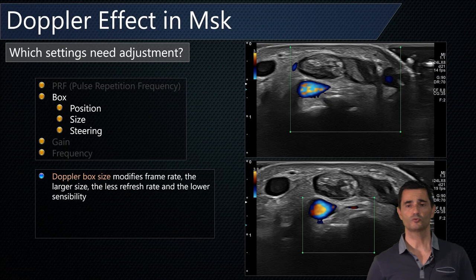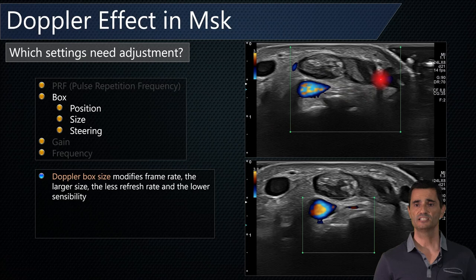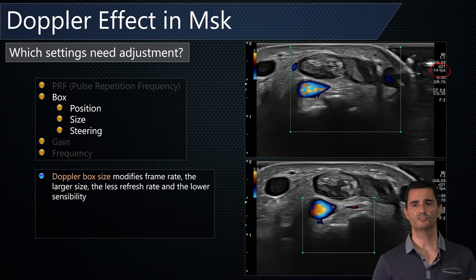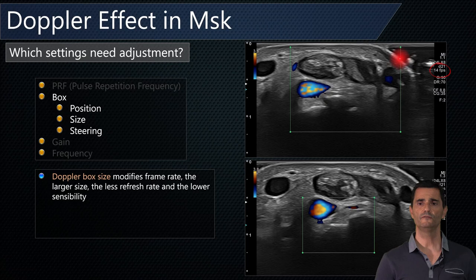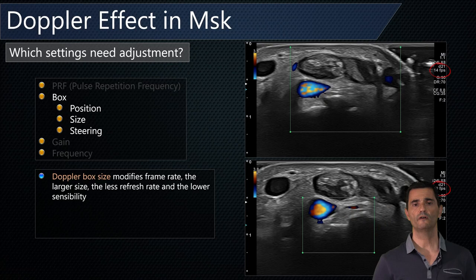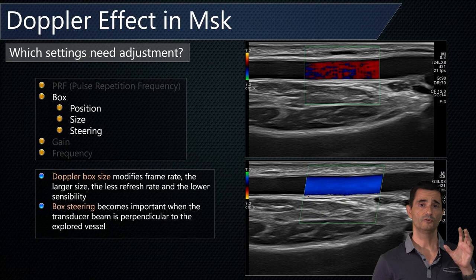You can use the Doppler box — place it where you want to investigate the Doppler and adjust its size. You may think a bigger box is better because you see more vessels, but with bigger boxes the frame rate decreases and you will have a poorer image with slow flows. To get a good image with good Doppler movement, make the box smaller so the frame rate increases and you get a better result. Also, remember to steer the box when you have perpendicular vessels at 90 degrees to get a better view in color Doppler.